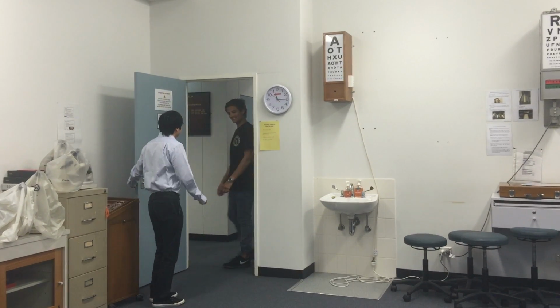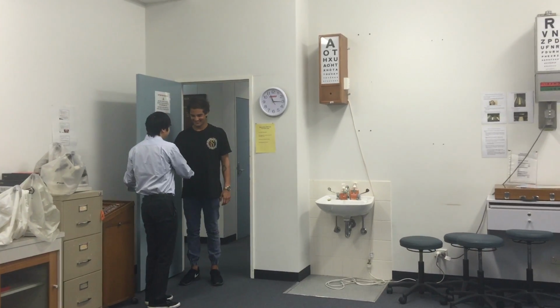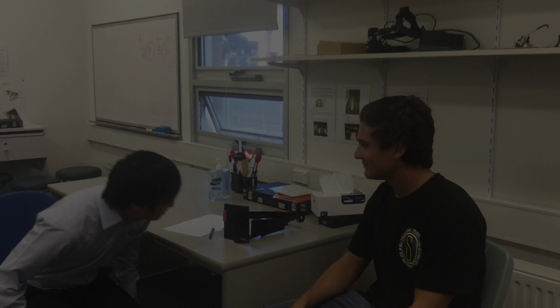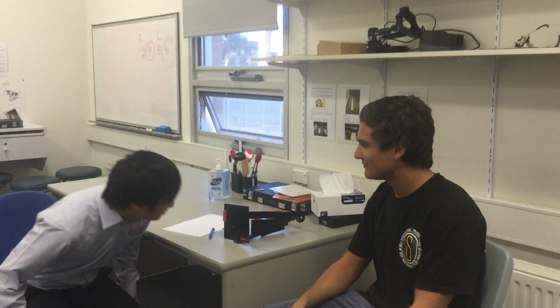Okay. Yes. Nice to meet you. I'll be your orthoptist for today. Could you just go have a seat over there? Make sure there is good lighting. So today we're just going to do some eye tests on you. First we'll start off with this.